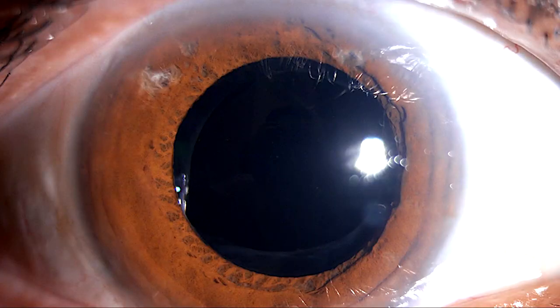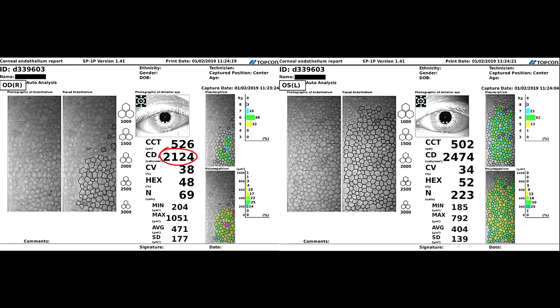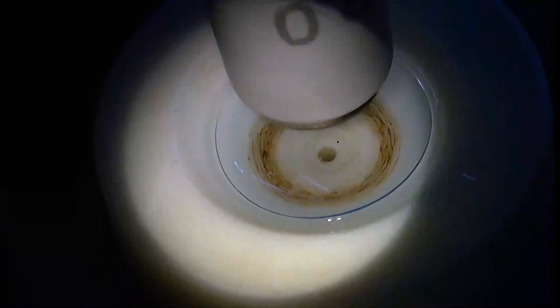This is how the eye looks 2 weeks post-op. The cornea is clear and the vision was 20/20. The endothelial cell count shows a 15% drop compared to the other eye at 3 months.